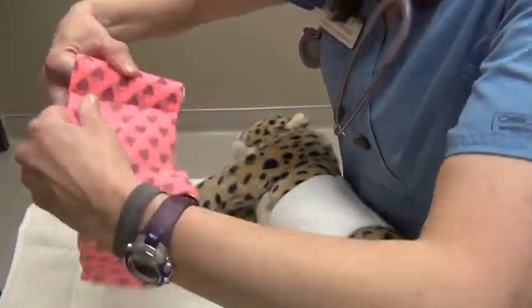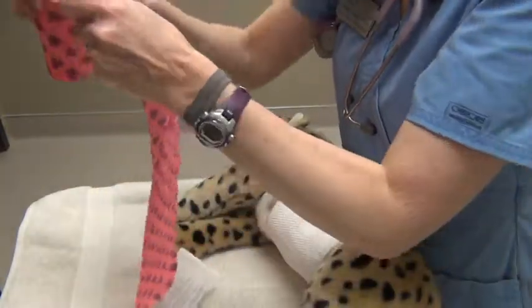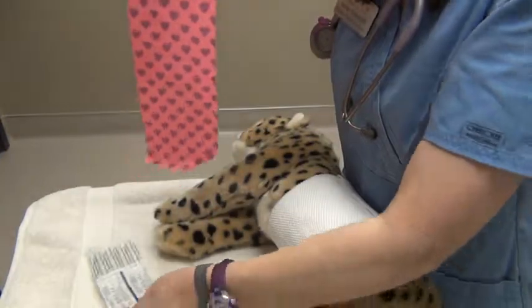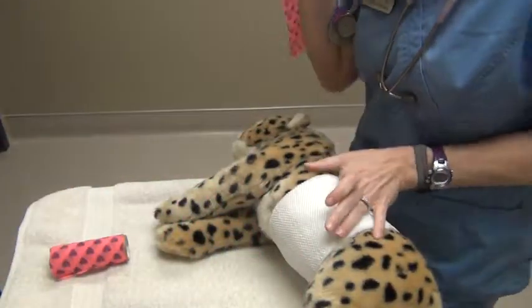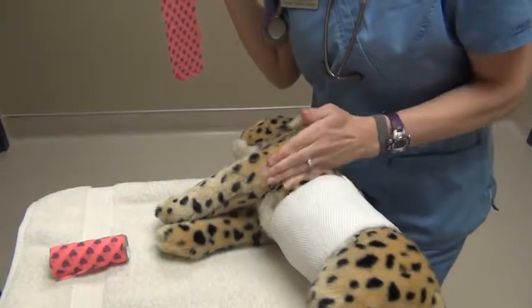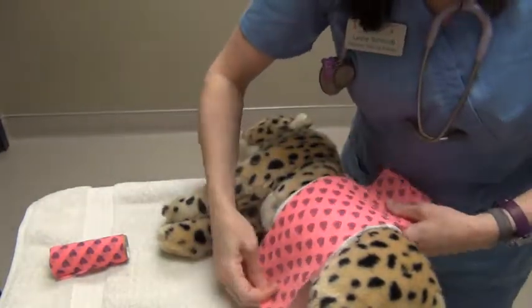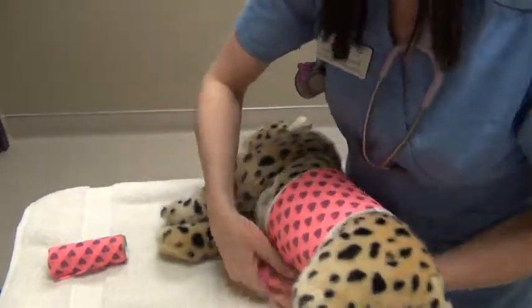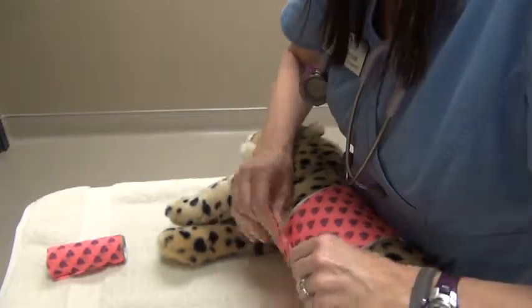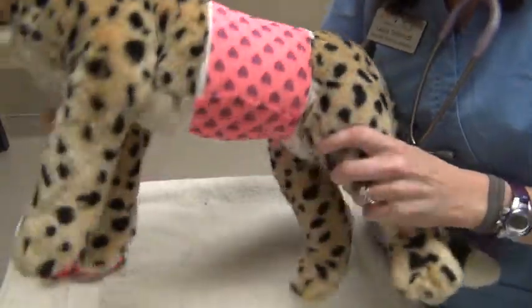Now we're going to go ahead and finish with the vet wrap. And this is self-adherent, so we won't be placing any tape on this, but you can secure abdominal bandaging with tape on either side of your vet wrap if you want to fasten things down a little bit more securely. So we're going to go ahead and place the vet wrap on top there. And that is a simple abdominal bandage on this patient.